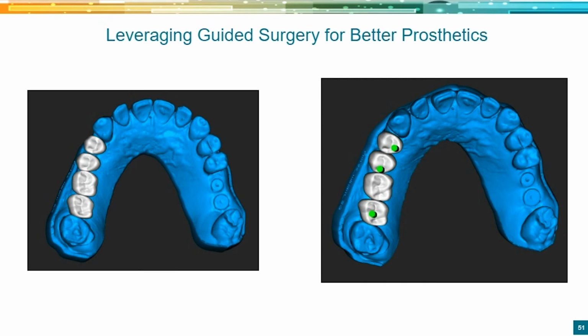And an interesting thing about splinting long span implant bridges is you actually don't want the implants to be in a straight line. So you might be wondering, why is that middle implant off to the buccal? It's actually because we don't want to have one axis of rotation, believe it or not. So you don't want to have your 3 implants in a straight line. You're actually offsetting the middle implant to give a little more stability when the patient bites on the buccal or lingual cusps of this bridge, because if you can kind of imagine, it's a little bit more stable and it's not all rocking on the same axis of rotation.